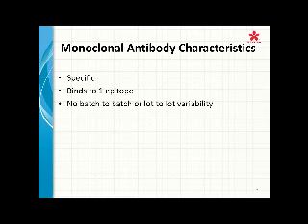I'm going to go over again how monoclonal antibodies, just like polyclonal, are derived. Monoclonal antibodies are prepared by injecting mice with an antigen. The antibody that's produced by the mouse can be produced in unlimited quantities by tissue culture or by transplantation to peritoneal cavities of mice. Although other animals can be used, generally monoclonal antibodies used in the histopathology laboratory are derived in mice. Because they're generally always derived from mice, unlike polyclonal that can be derived from different animal species, they're much easier to standardize, and you're going to have more specific staining with them. So it actually is more specific to one epitope.